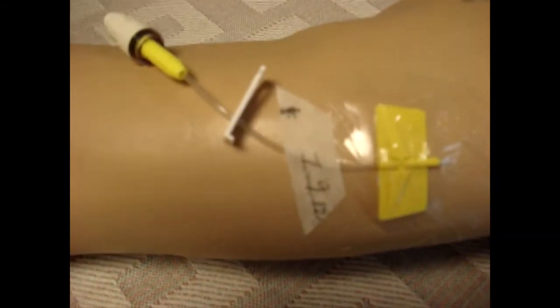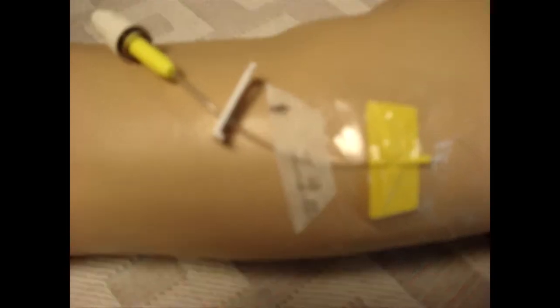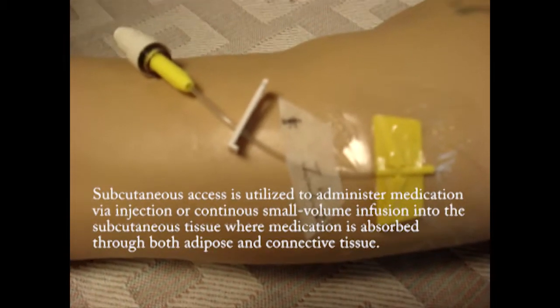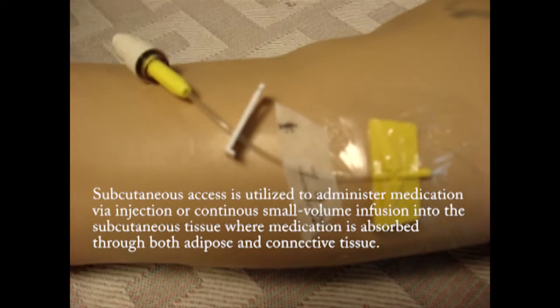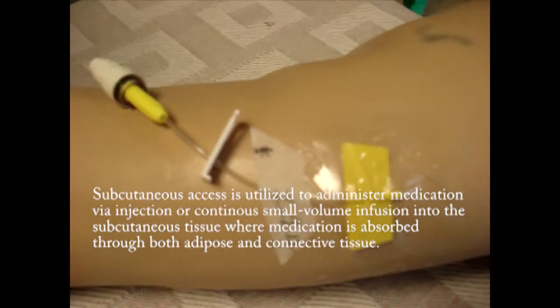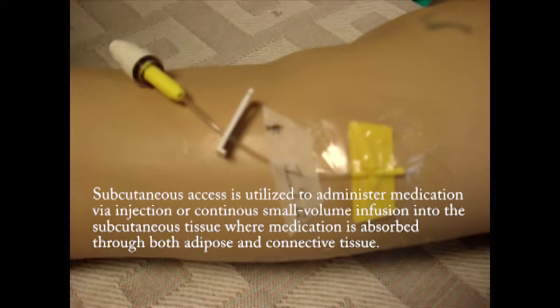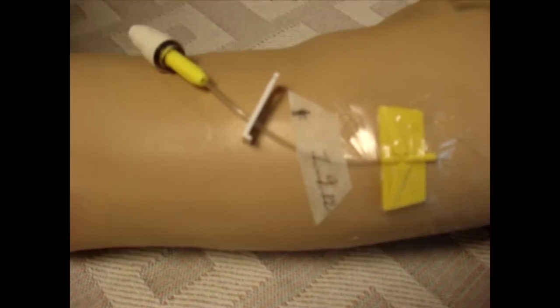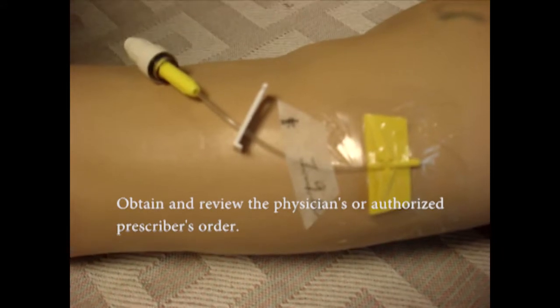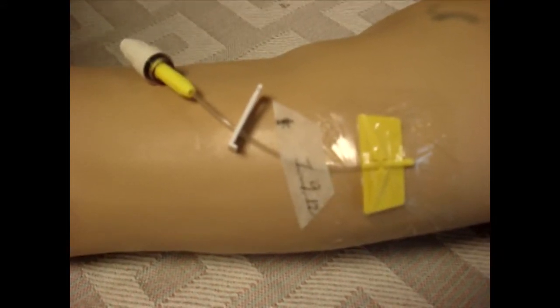This video will teach you how to insert a subcutaneous butterfly. Subcutaneous access is utilized to administer medication via injection or continuous small volume infusion into the subcutaneous tissue, where medication is absorbed through both adipose and connective tissue. Upon a physician's or authorized prescriber's order, a nurse may initiate and manage subcutaneous infusions.